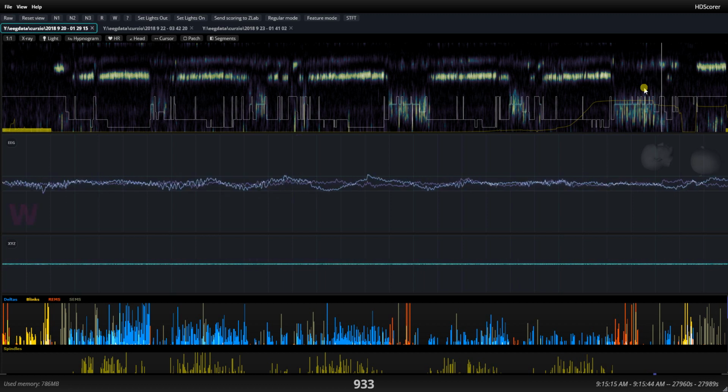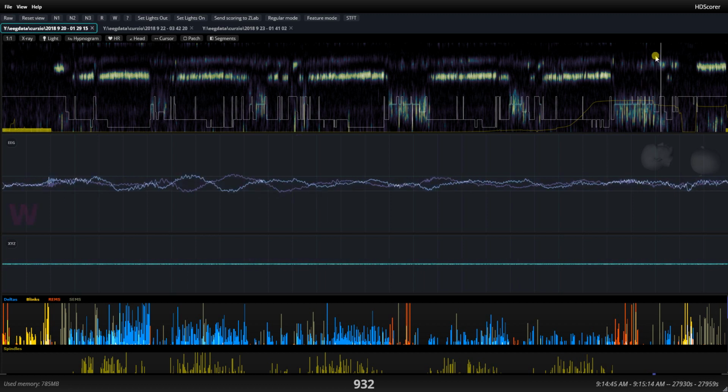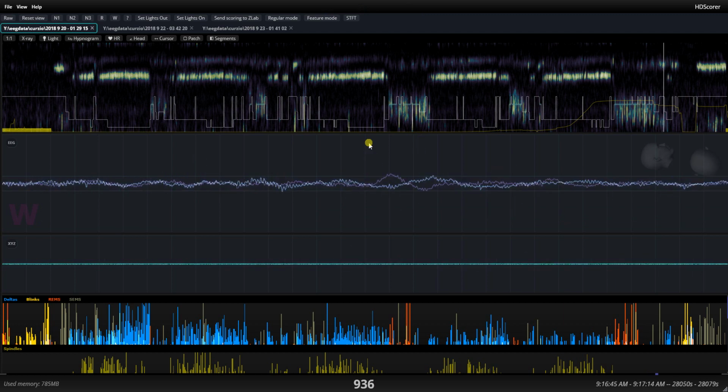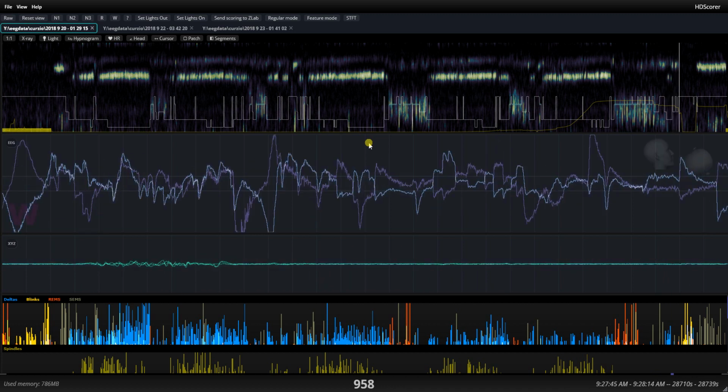And there's wake. Wake is happening because of strong alpha activity, which you can see here. There's also slow rolling eye movements. So period of drowsiness. So this is definitely not REM sleep. And then there's the actual awakening. Then we go back to N2. Okay, so it's basically perfect.